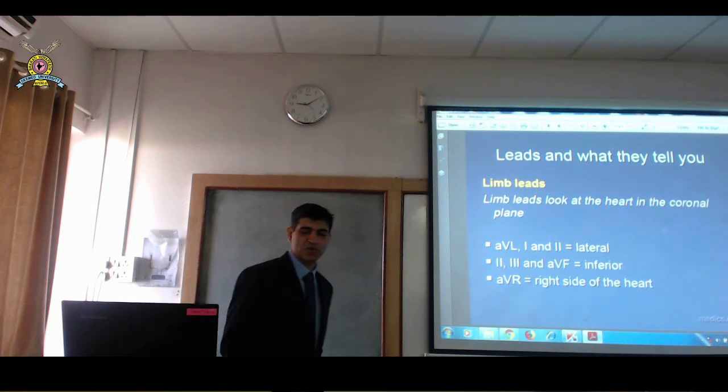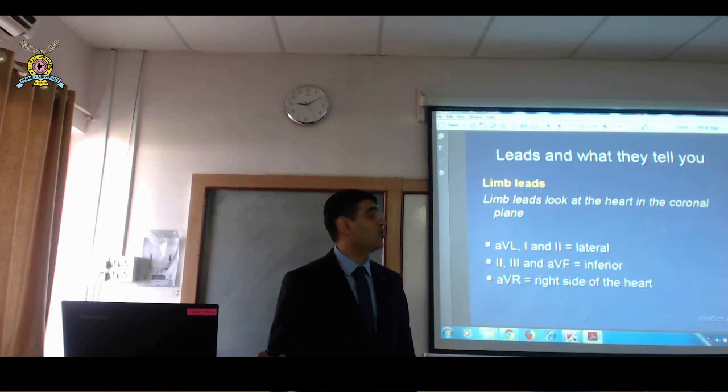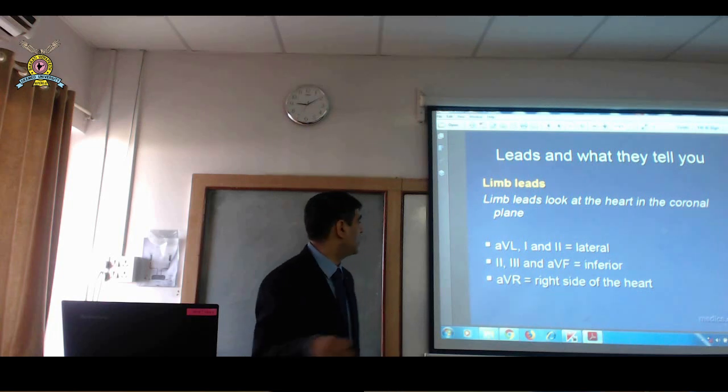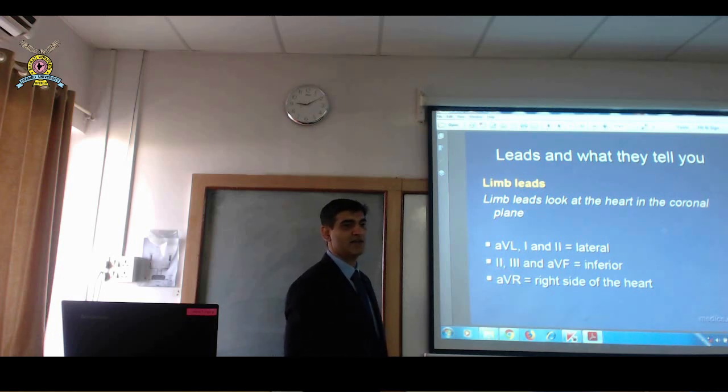So we always ask you as exam students, or somebody asks us, tell me where is the infarct, right? Somebody mentioned 2, 3, AVF just now. Which wall is 2, 3, AVF? Inferior. Yeah, is it written somewhere here? 2, 3, AVF inferior. Okay. AVL, 1 and 2 is lateral.